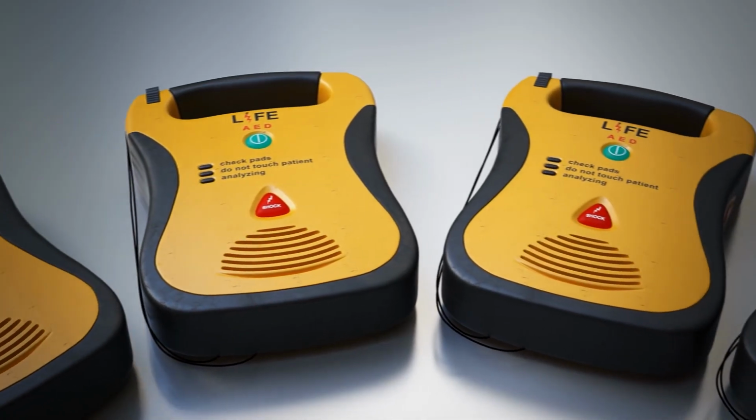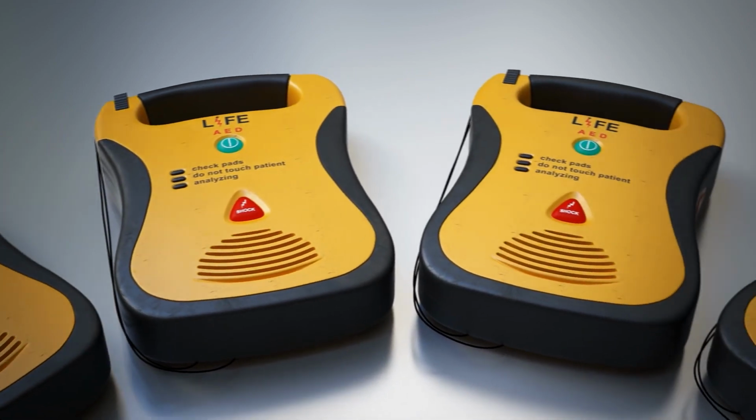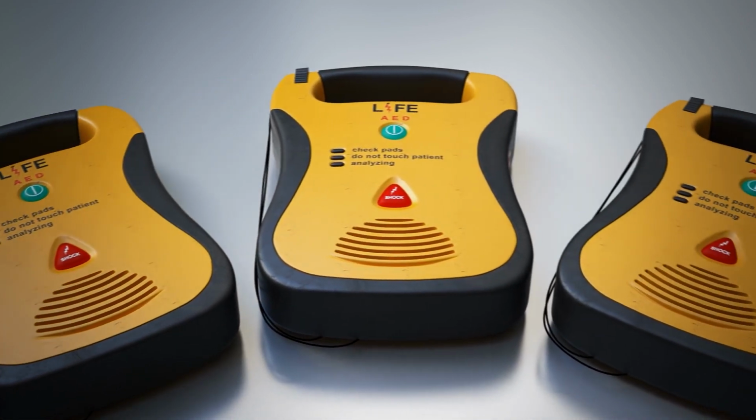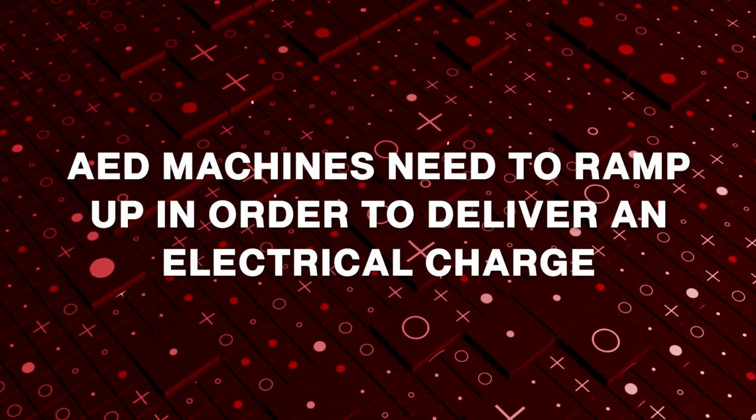Putting a quick video together today to talk more about AED machines, and a common question we get in a lot of our first aid CPR AED classes regarding getting shocked or getting injured or injuring someone with an AED machine. So the important thing that we want to take a look at is AED machines need to ramp up in order to deliver an electrical charge.